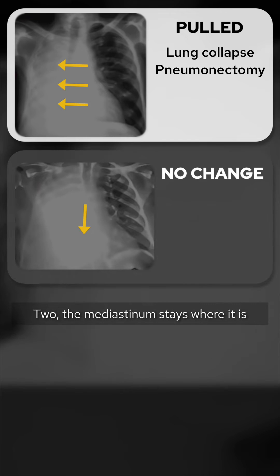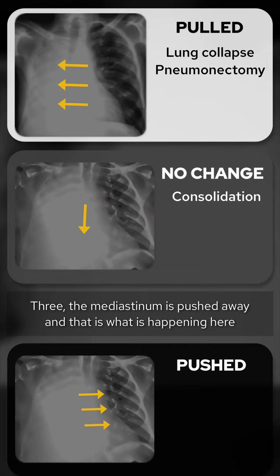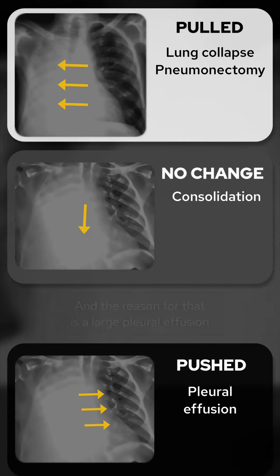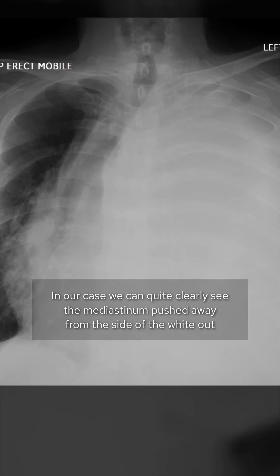Two: the mediastinum stays where it is. This happens in lung consolidation, most of the time due to pneumonia. Three: the mediastinum is pushed away, and that's what's happening here, and the reason for that is a large pleural effusion.